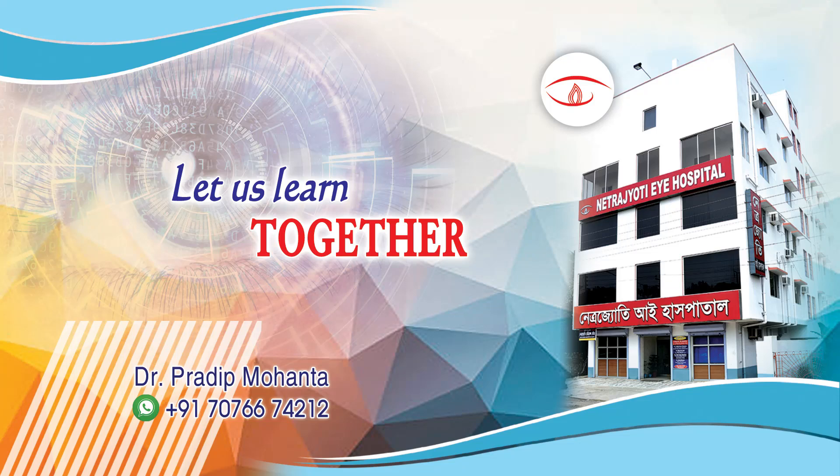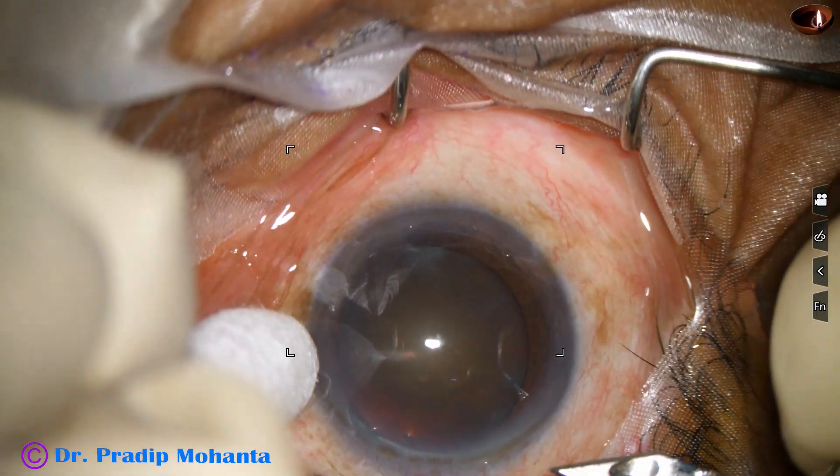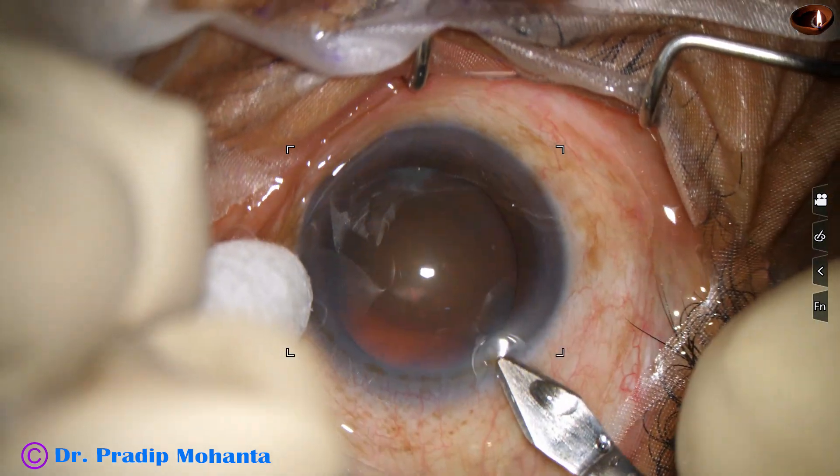Dear colleagues, welcome to my workplace at Ranagha, West Bengal, India. In this case, I tried a pre-chopper but could not divide the nucleus into two hemi nuclei. Let us observe this surgery.